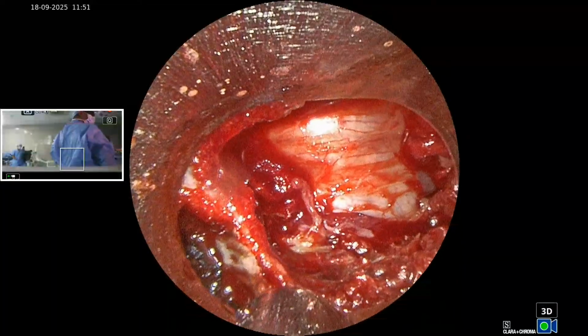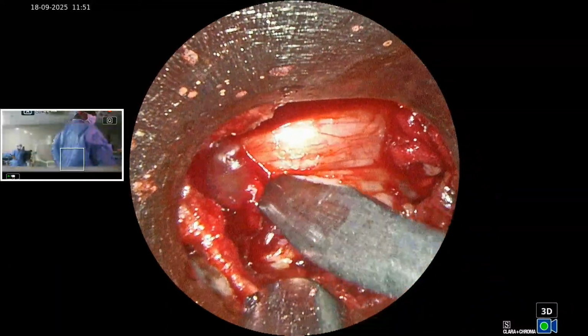So now let's see, is there any disc? Looks like a disc.